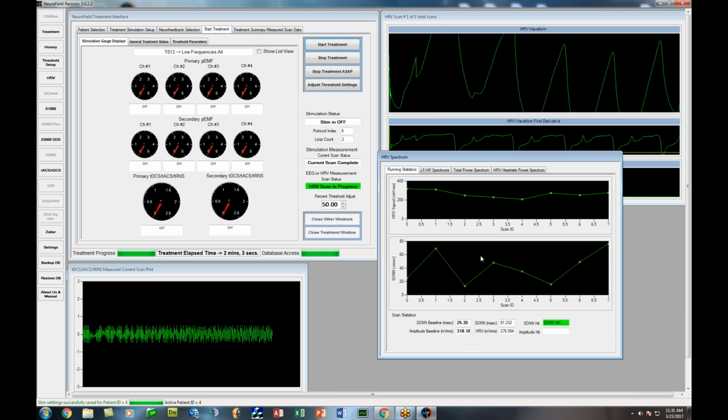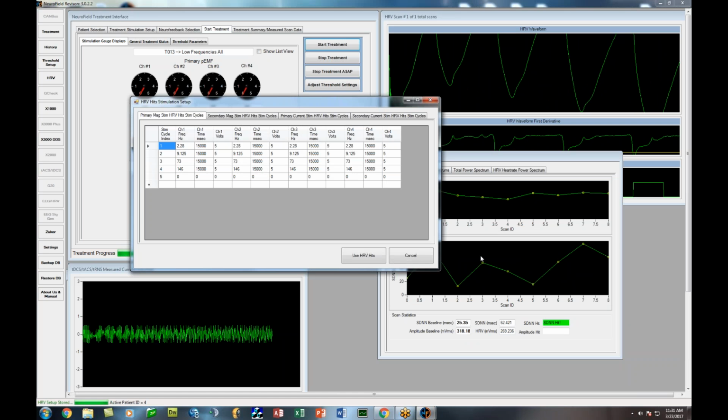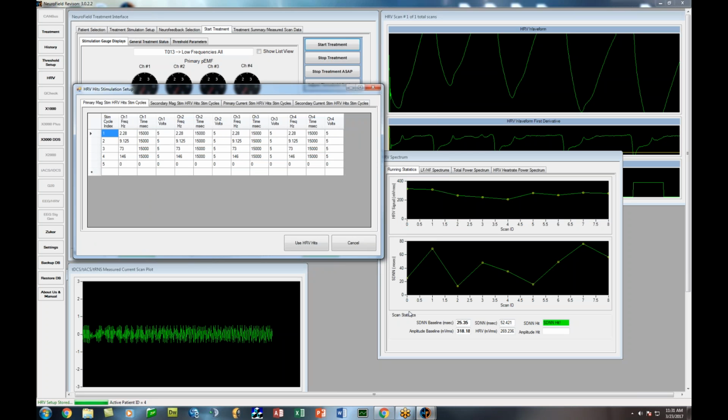Okay, and we're getting to the last stimulation here. It's going to measure a post-test. And once it does that, it pops open this window. Now it's telling you which ones were the hits. And you can see that there's 4 of them that actually were selected. And you want to look at the plot to determine which one you're actually going to pick.